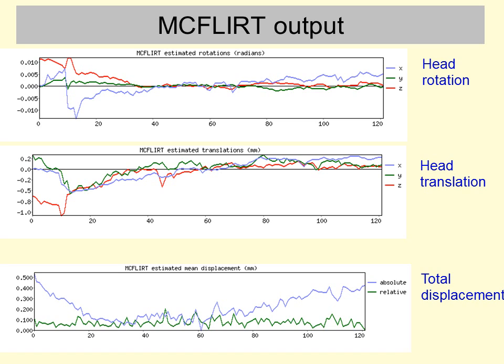And the same is true for this second plot here, the plot of the 3 degrees of freedom that are the translations that were made in X, Y and Z of the image of the head in order to match it to the position of the central reference image.